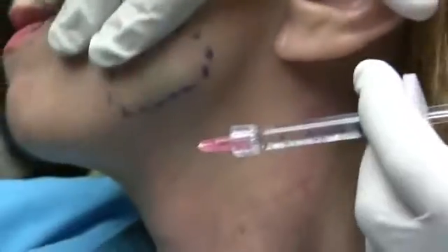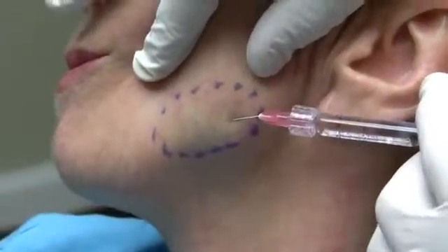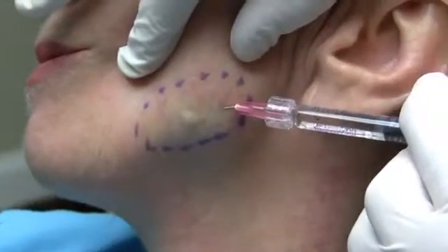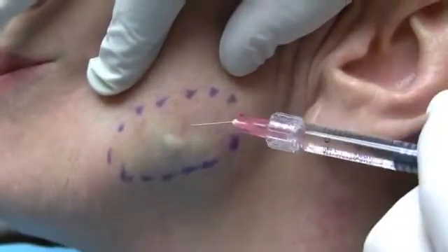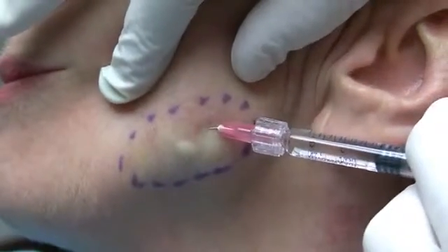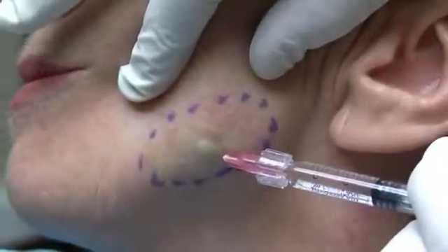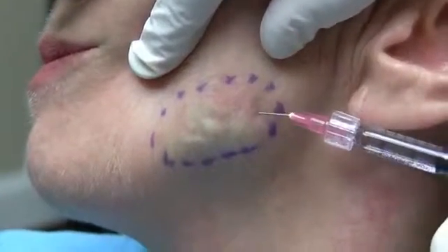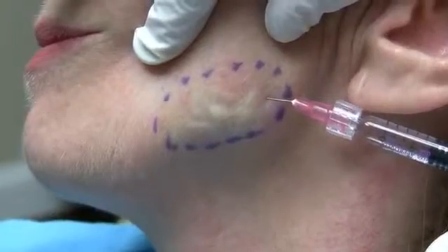So we're going to begin here on the mandibular defect, and I'm going to pull it up over the mandible to give me a little bit more of a stable base. For anybody that's familiar with topographic maps, how they have concentric circles that are wider at the base of a mountain, and then as you approach the top of the mountain, the circles are piled on each other and become thinner. That's the same type of situation that I want to do here.